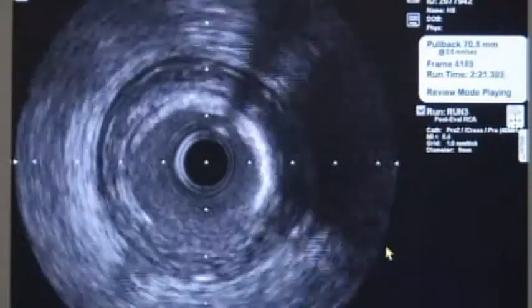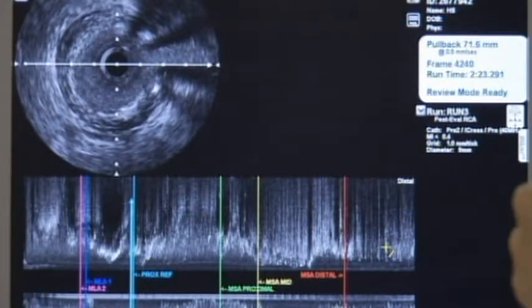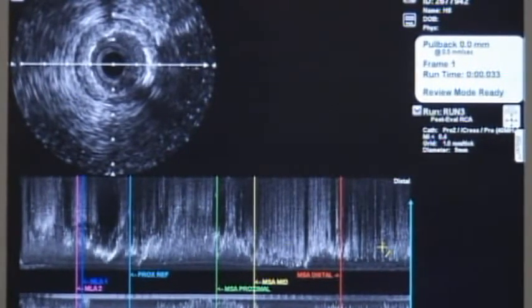Well, with the FFR in the lab, I think the spot stent would be nice. Yeah, if my partner Gas Pichard were here, he would scream that he wants to see spot stenting. But often what happens when you do the spot stenting, you still have the gaps of some disease, and that disease looks even worse. So I don't know. At the end, you add all those stents. If you make a decision to go with full metal jacket, you should use the longest stent that you have, and maybe you can end with 2 stents. I think the IO also comes in 38 millimeter, and you could probably have done it with fewer stents, but I'm not sure if it's available.